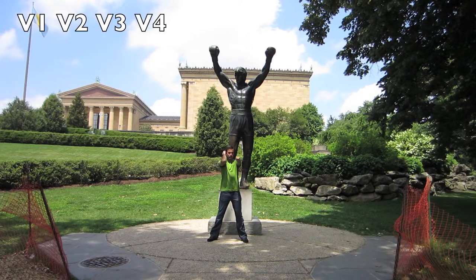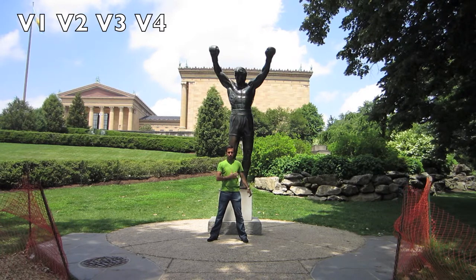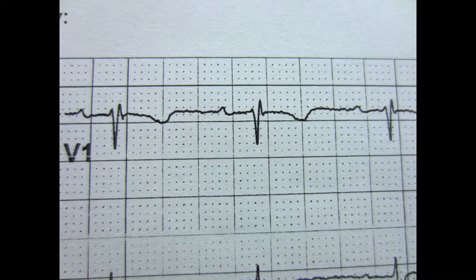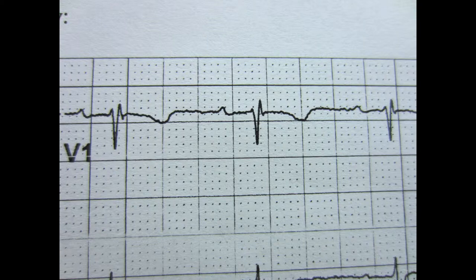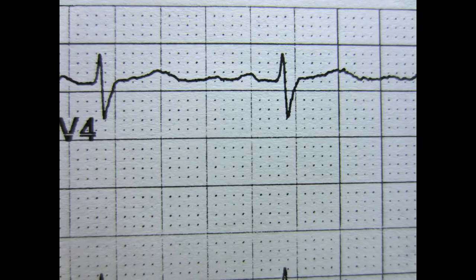Finally, the anterior leads: V1, V2, V3, V4. This correlates with the LAD. There's an inverted T wave in V1 after an RSR prime, some T wave flattening in V2, no ST changes in V3, and no ST changes in V4.